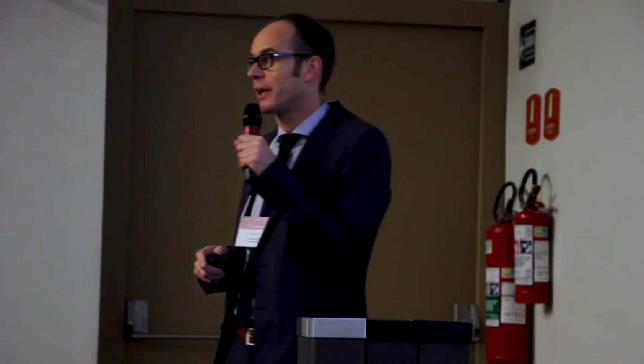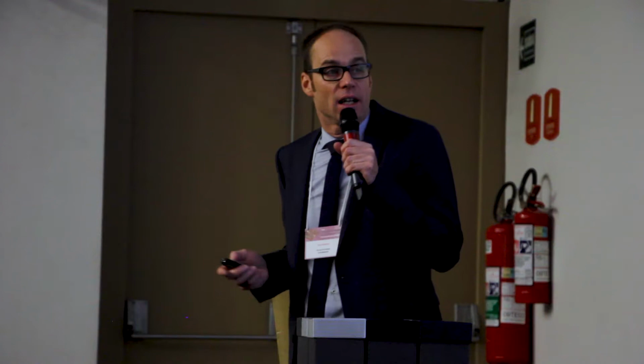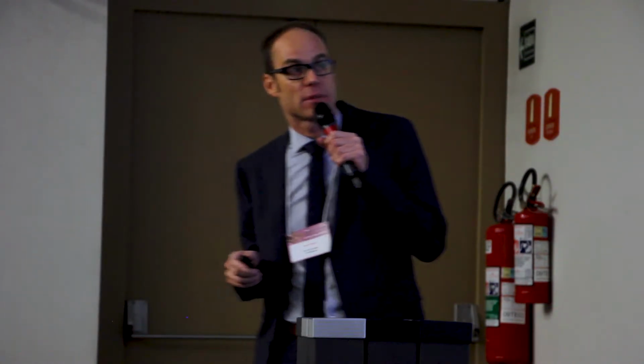But of course, one drawback of immunofluorescence is that it's time-consuming, it's not standardized, the reading is quite difficult, and you need a lot of experience. But then in 2010, automated systems came up. These automated systems are now able to automatically take pictures of the Hep cells, evaluate the images and give a pattern.